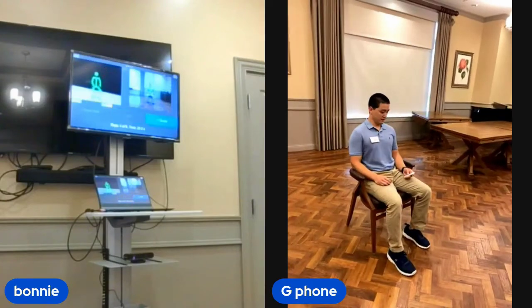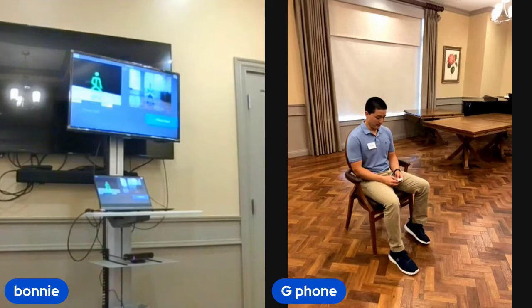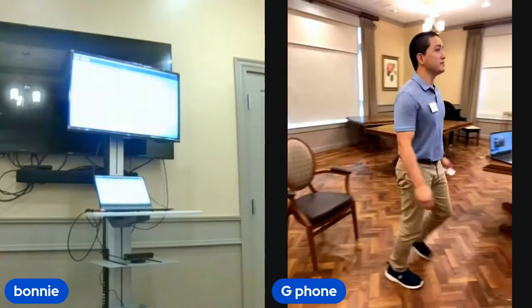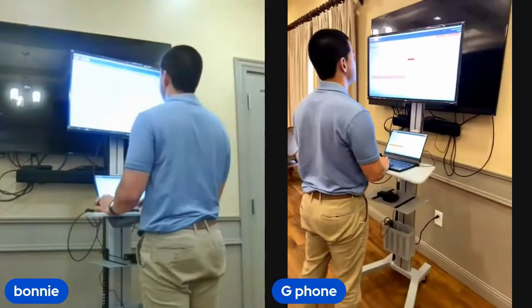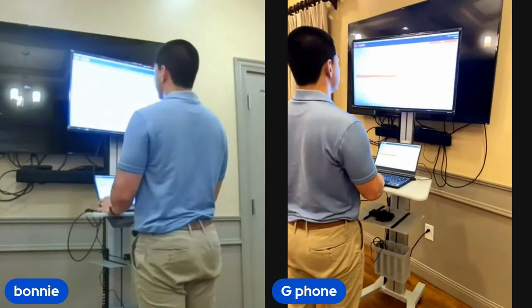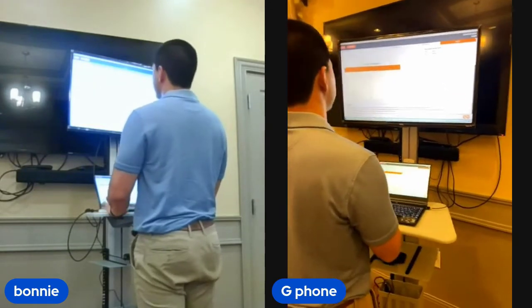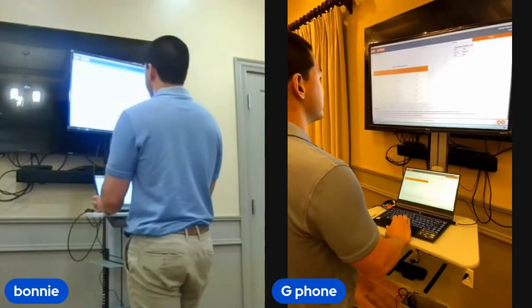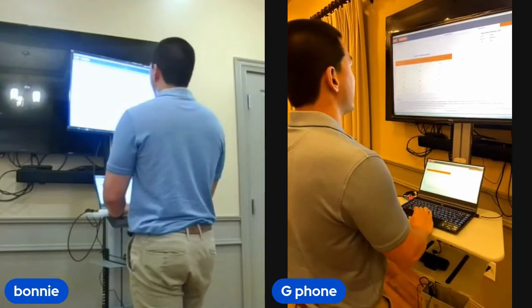Test completed. Press next to finish the test. We're giving a time, so ideally you want that time to be under 15 seconds. Then we'll also get some input. Low mobility, that's great. So you can see it'll catch that. They lean to the left, approximately 14 centimeters. You can see that on some of these reps. And you can see the time on each rep.